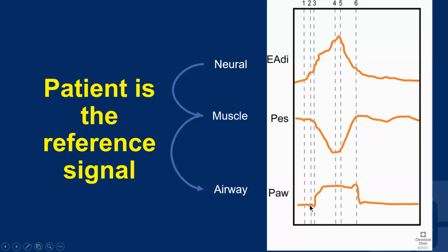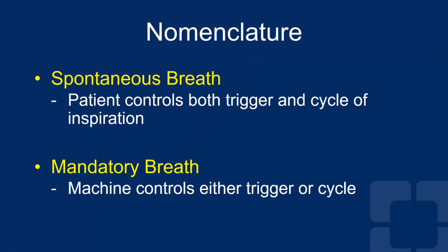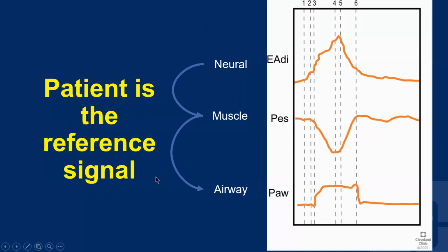The other term that you're going to hear me talk about is discordance. In the literature, usually we use the terms synchrony, asynchrony, and dysynchrony to describe the patient-ventilator interactions. However, if you go through what etymologically each one of those words means, we really are describing very specific interactions that occur between the patient and the ventilator. So a more general term that we use is discordance, which means lack of agreement or consistency between the patient and the ventilator.